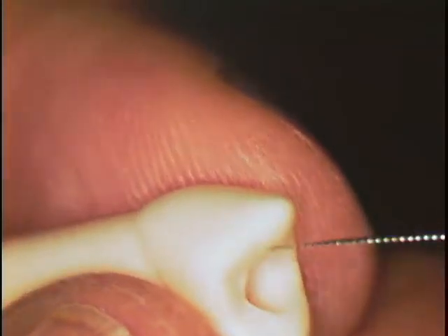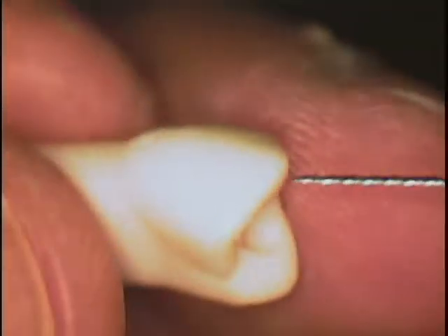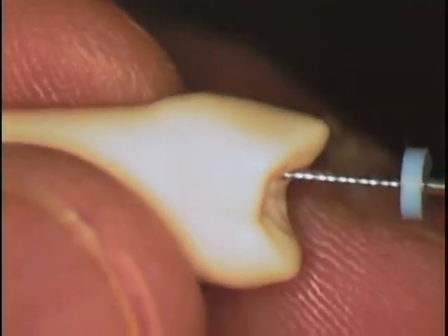So then again, what's the file we use? The number 10. Exactly. I'm going to go back in, maybe lubricate a little bit. I'm patent all the way through. So now you can see I'm starting to create my apical constriction, and I'm already up to a number 35. By the time you get to a 40, you're going to be finished. It's very easy to push a 35 or a 30 through the apex.